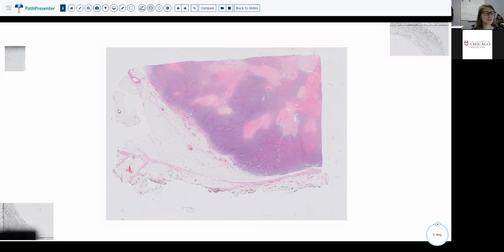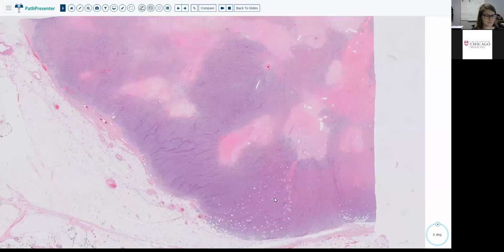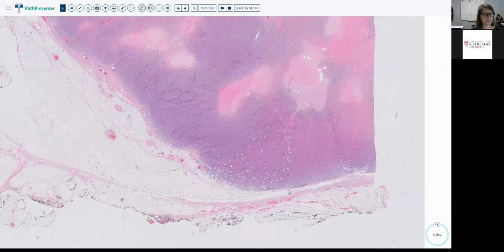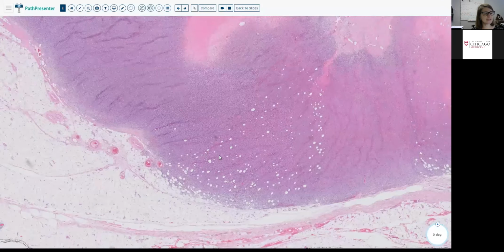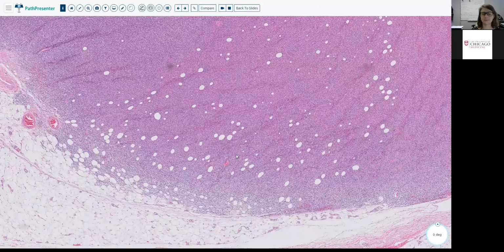Nobody likes the remote control driving. I struggled with it last time, if I'm honest. I think it's really hard if you have a touchpad, easier if you have a mouse. Anyway, here's a neoplasm. If you guys don't drive it, I'll drive it, but who wants to describe this thing?